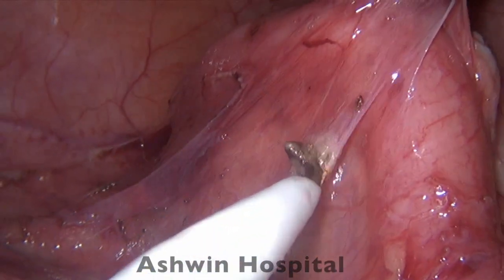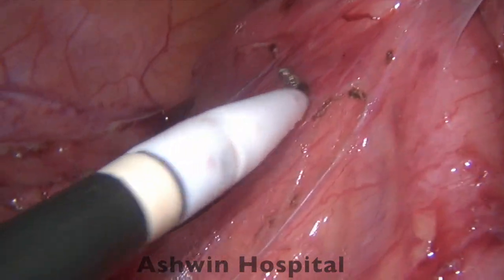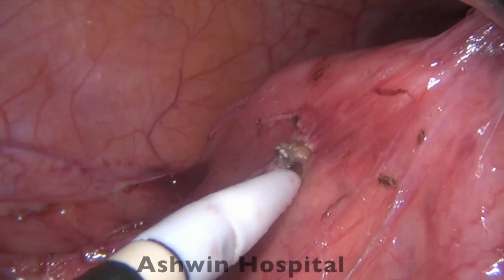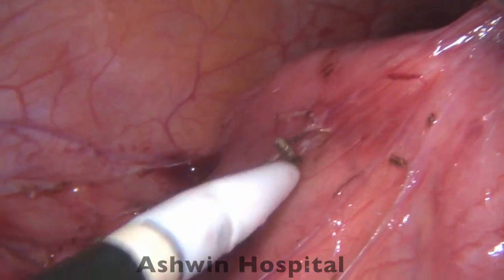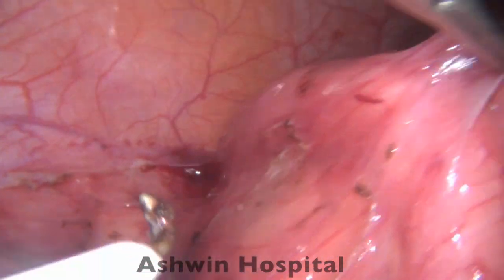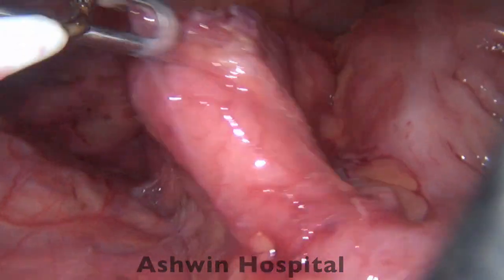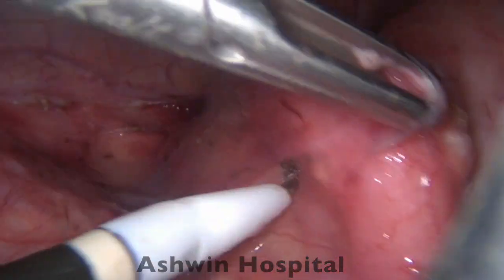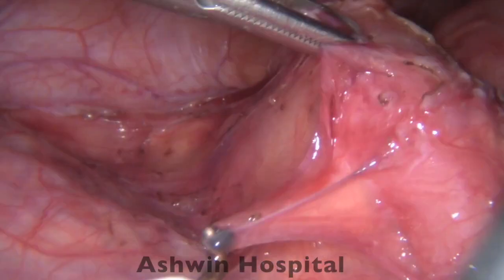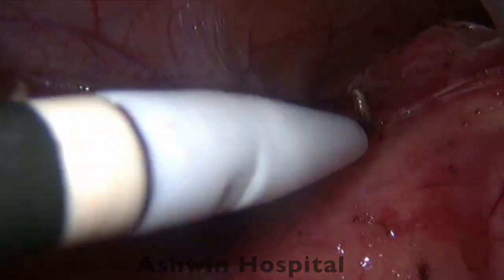We are just using cautery and trying to identify the exact plane. Whatever small fascial attachments are present that are not conventional are divided, and we are dissecting so that the appendix can be visualized all around. We are getting an idea of where the tubular structure runs, and this will be helpful for further dissection.